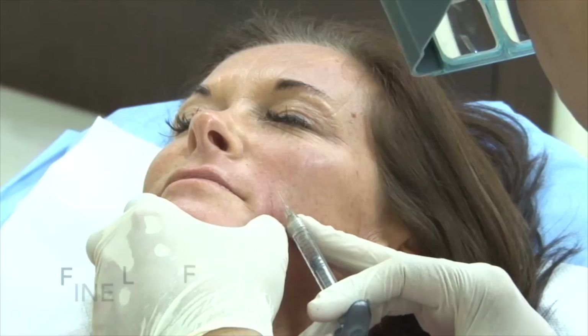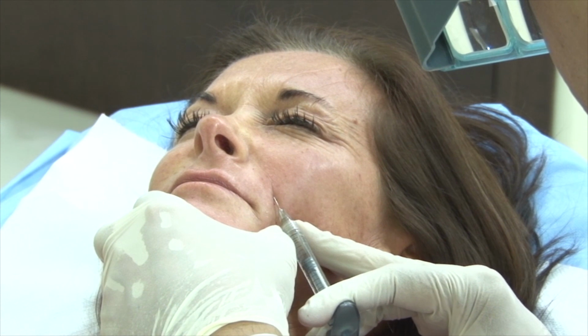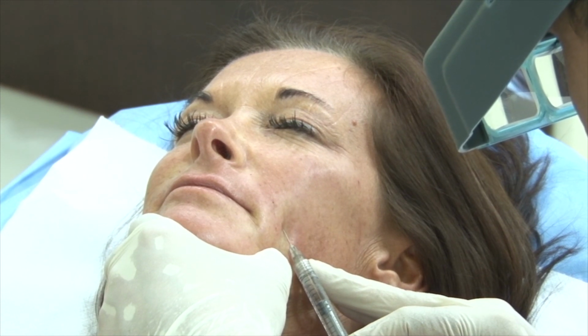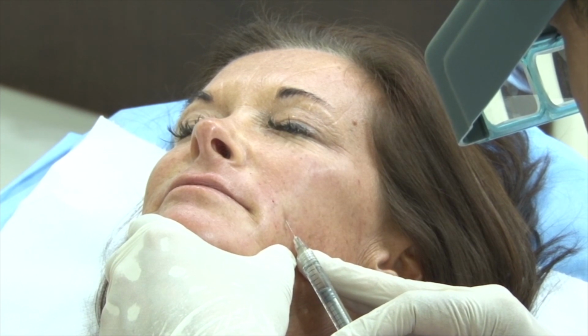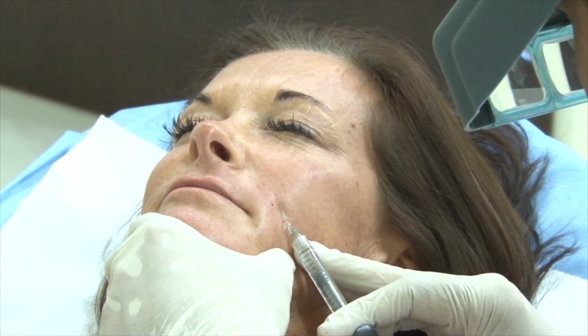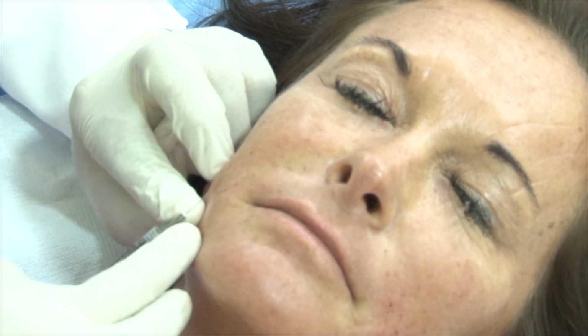And then I make the patient sit up and assess. Now I am correcting fine line using very thin filler. These are radial creases that some patients get on smiling in the cheek region. The key here is to just inject a droplet of filler in the crease or in the subdermal area to stretch the dermis. Avoid injecting linear deposits as it may cause a sausage shaped lump eventually.